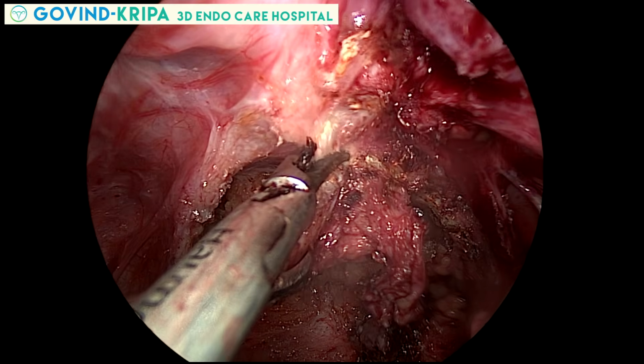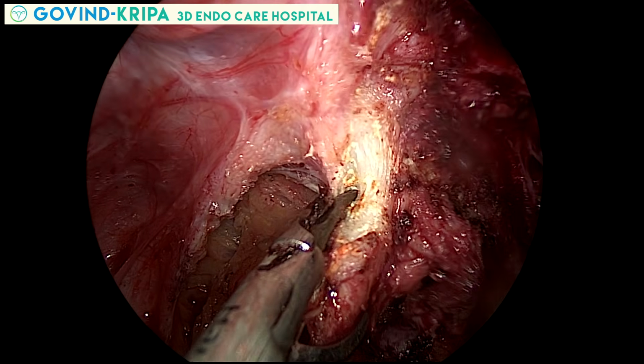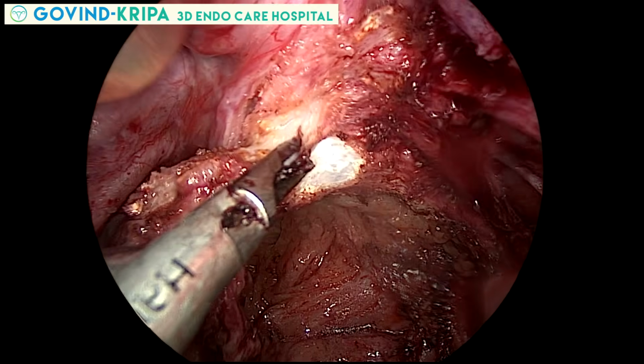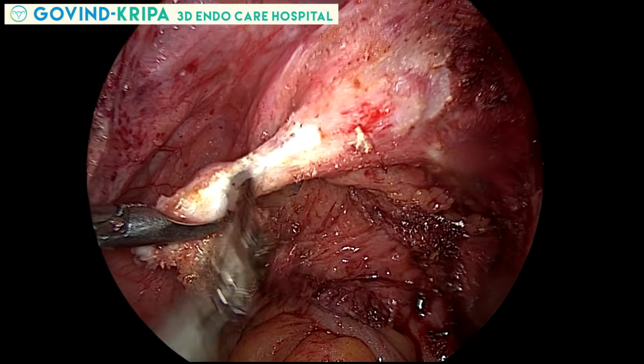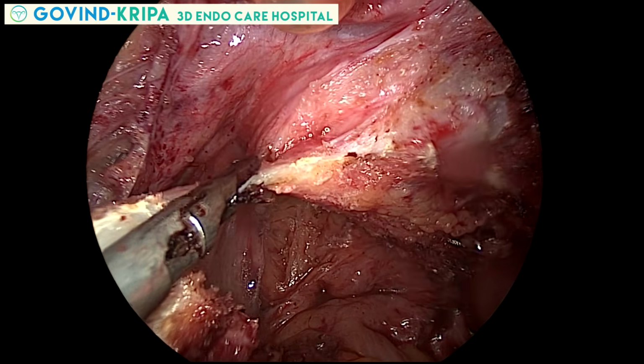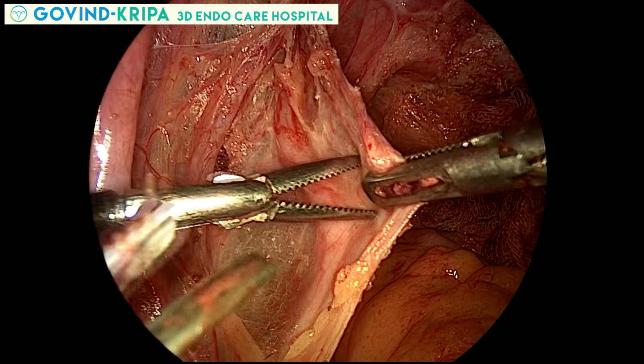Disease of the torus is also cut excised. Torus is the region which is posterior to the cervix, and this is considered to be the epicenter of the disease in most of the cases. The ovary and the torus, these are the very common areas of the proliferation of the endometriosis.